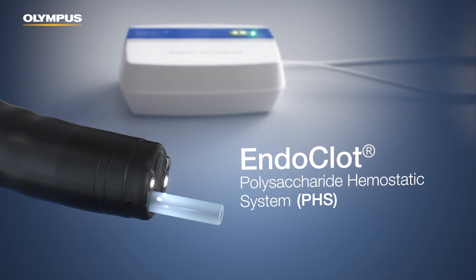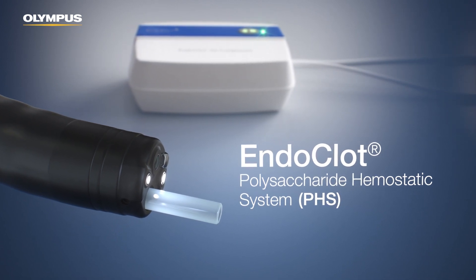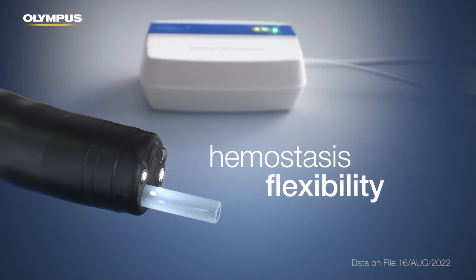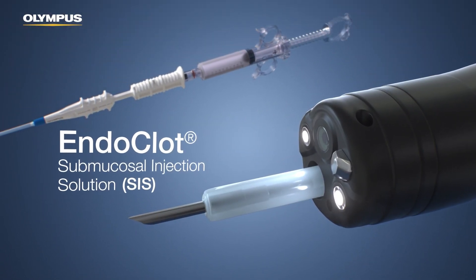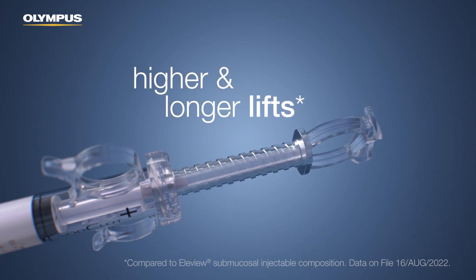Introducing the Endoclot Polysaccharide Hemostatic System, PHS, intended for hemostasis flexibility, and the Endoclot Submucosal Injection Solution, SIS, intended for higher and longer lifts.